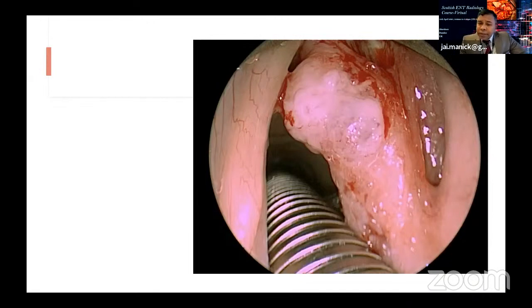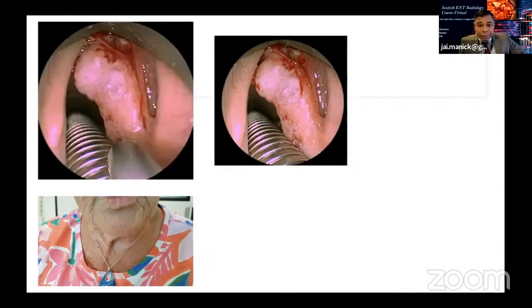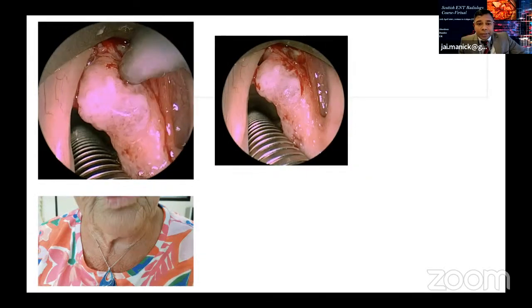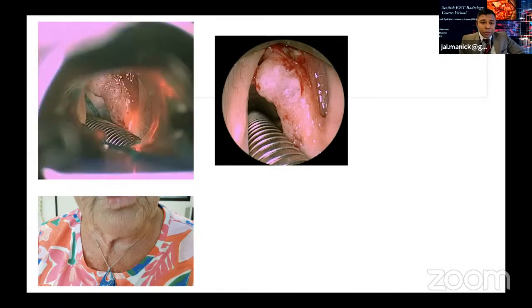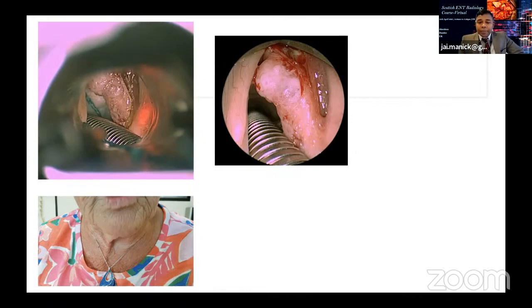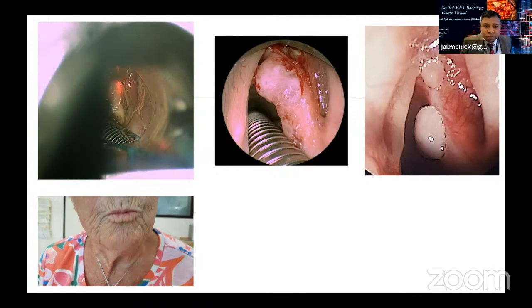But this one is a relatively large lesion, and in this case you want to know whether there is any paraglottic space involvement, because that takes the staging to T3 straight away. In this case, there's no paraglottic space involvement, so I have done this by transoral laser surgery. You can see I'm palpating the lesion, but I knew well before that it is a bulky T2 lesion, removing the cancer from the voice box.